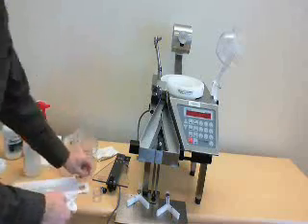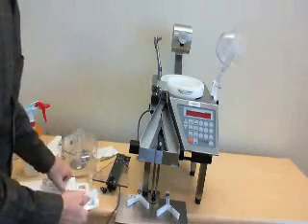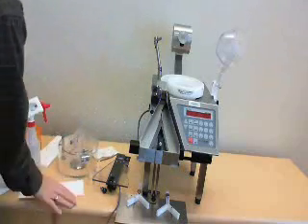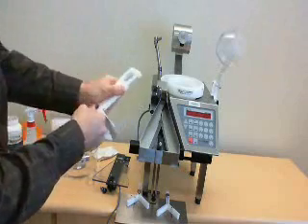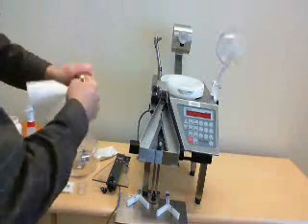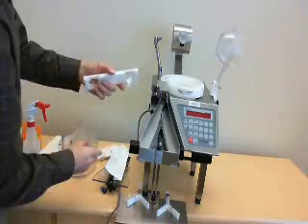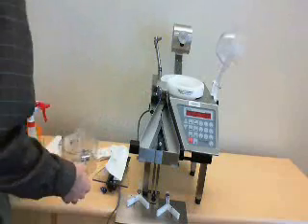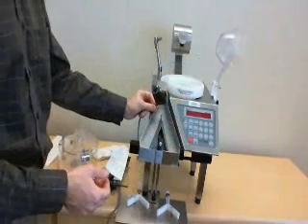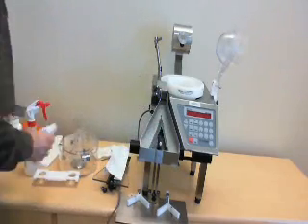The funnels are cleaned. Follow your normal procedures as to how thoroughly you normally clean to ensure that no residue is remaining. And then dry off. These then snap back into place. Next, we're going to remove the components inside. This flag ensures that the medications that are flowing through are going to the left channel or the right channel. This as well is cleaned.